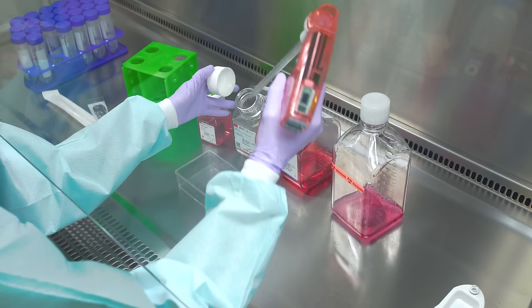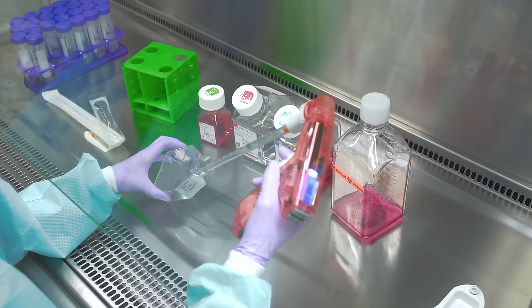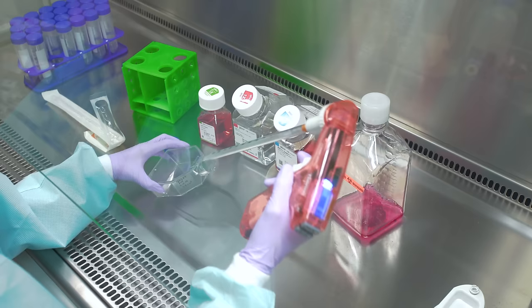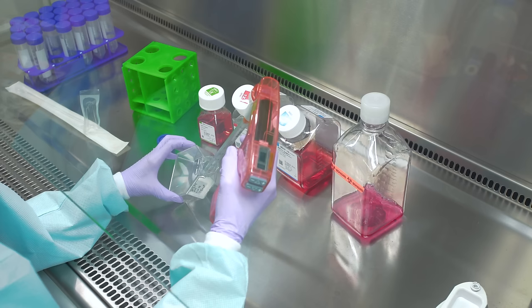Rinse the cells with a balanced salt solution such as DPBS. Make sure to use a salt solution without calcium and magnesium, as these may inhibit your cell dissociation reagent. After rinsing the cells, remove the salt solution.